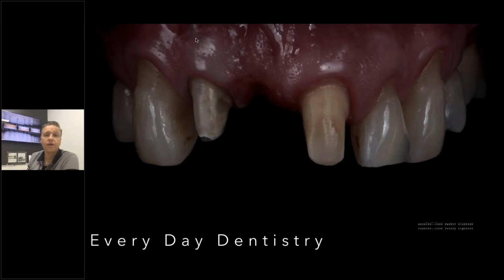You don't want people seeing the bridge in his mouth later on and saying, "Oh, you have a bridge? Oh wow, okay, looks okay." No, you want that patient to have new teeth so that people don't even see it's a bridge, or that he has something artificial in his mouth. But one problem here is that we have two different preparation stump shades. You see one is more gray, the other more yellowish or brownish.